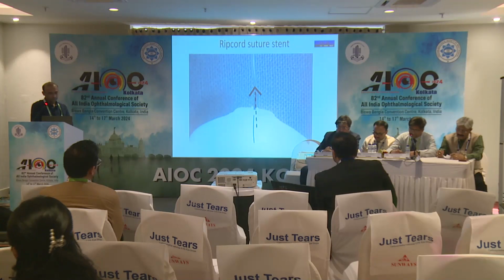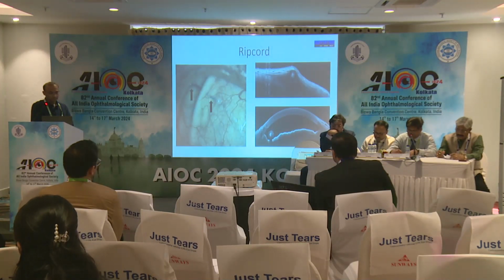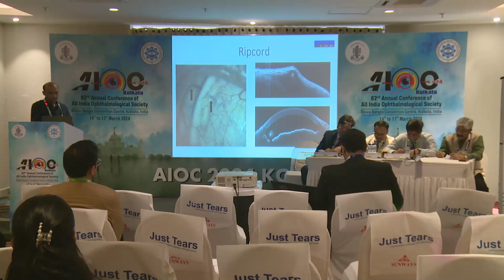A 3-0 multifilament nylon suture is threaded into the tube at the time of the surgery. Removal, if needed, can be done after 6 weeks, after dissolution of the external tube ligature.